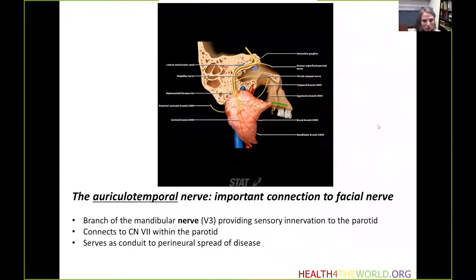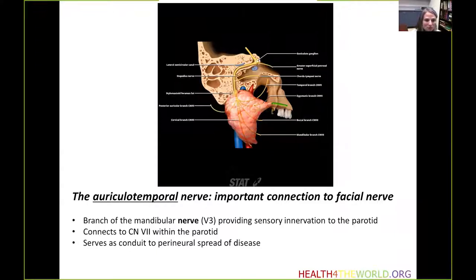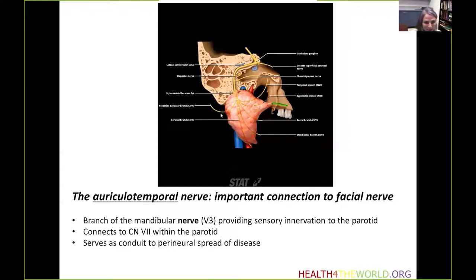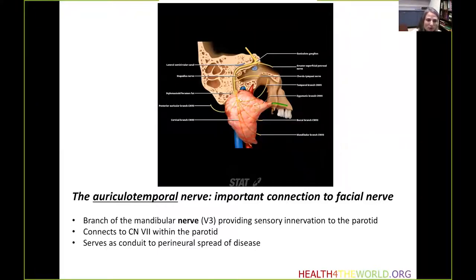An important structure within the parotid space is the extracranial segment of the facial nerve. This sagittal graphic demonstrates the intracranial aspect of the facial nerve that goes through the mastoid bone and exits through the stylomastoid foramen to enter the parotid space, where it gives off six branches. Lesions originating within the parotid space will have great access to this nerve and may travel via its branches intracranially.